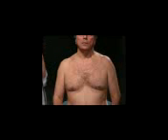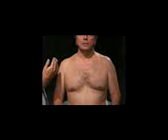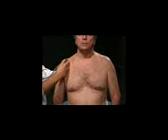Every time I put the stethoscope on your chest, I want you to take in a deep breath and then let it out. I'm going to start up here at the top of your lungs.